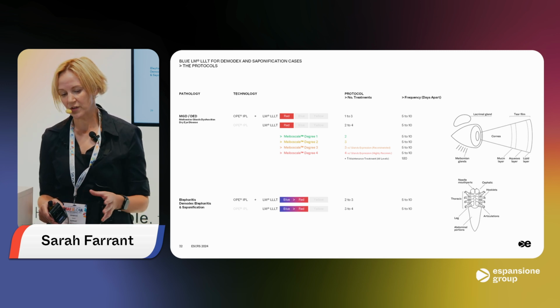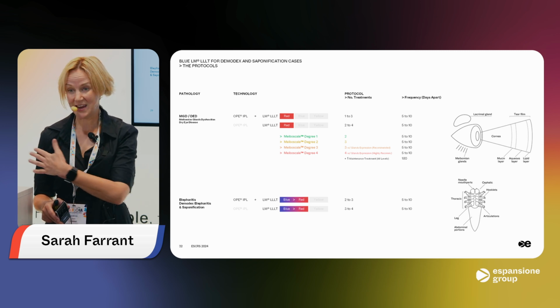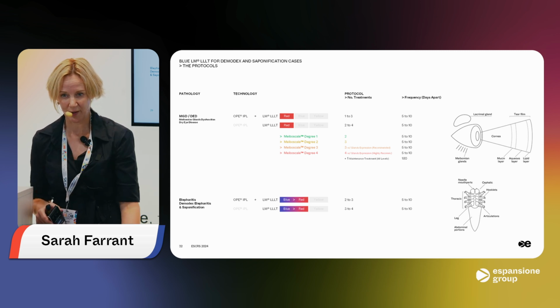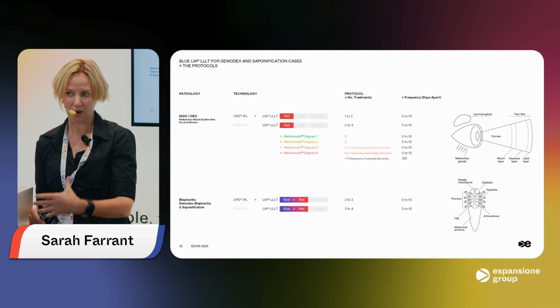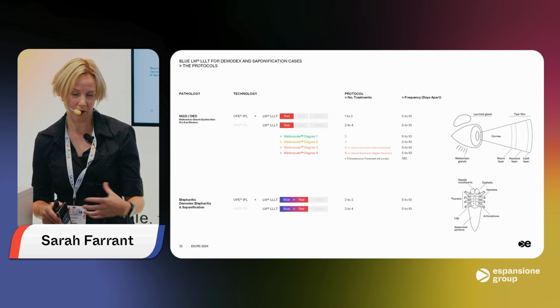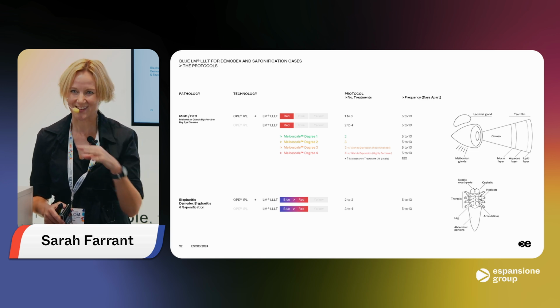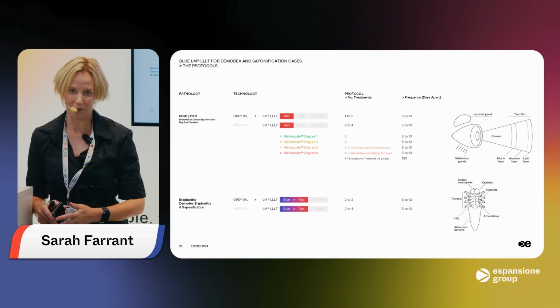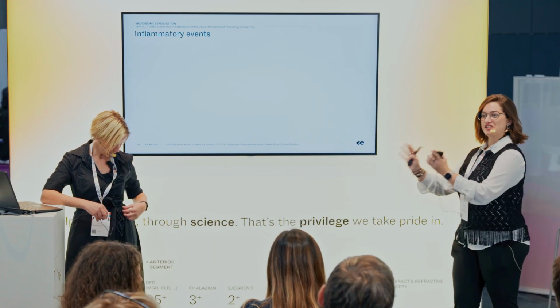But certainly I would go beyond that and say, nowadays I just make it part. I do a triad of light therapy. It's almost non-optional for me. If I'm going to manage them with light therapy, I want to be targeting that microbiome, and I just see it as a really under-considered element of the management of dry eye that we need to start thinking a bit more holistically.